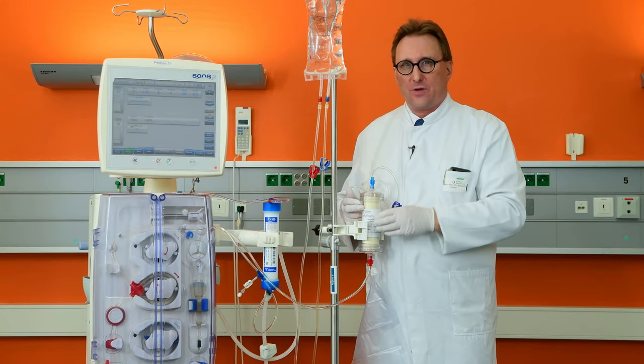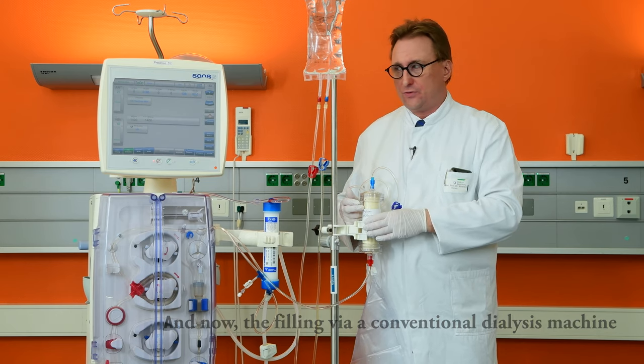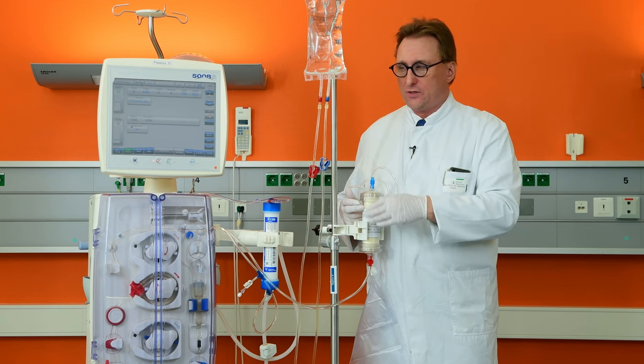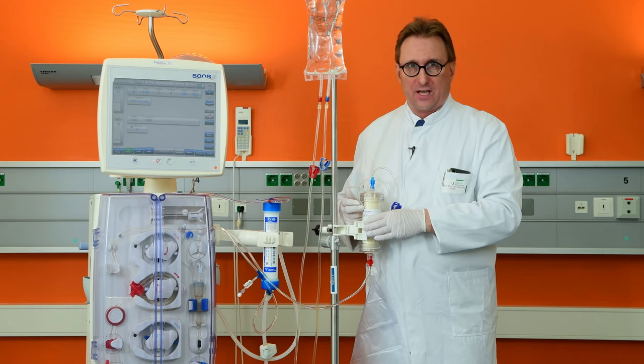Please prime your ordinary hemodialysis machine as usual. In case you have a substitution fluid pump for online hemodiafiltration, pay attention that you do not insert the tubing into the pump segment.